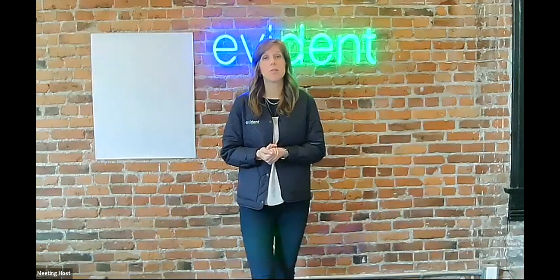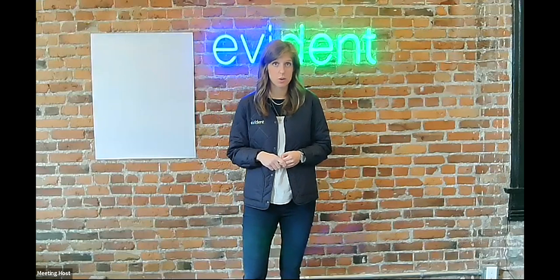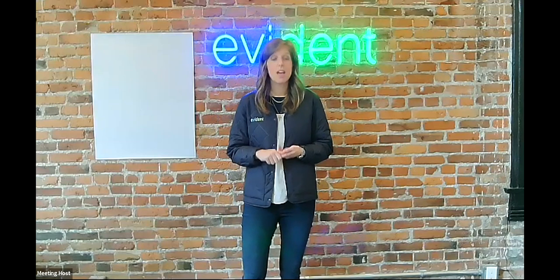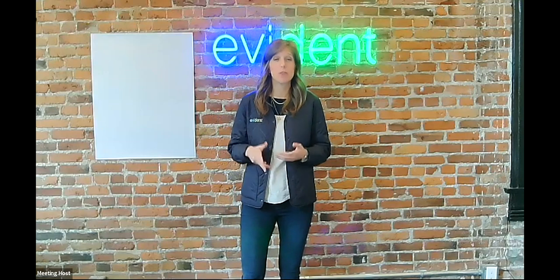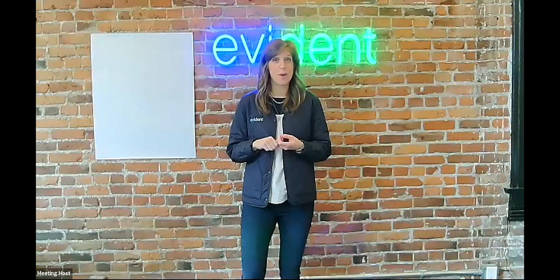So before we jump into it, we should probably talk about what is a dento. And you see I've shortened it up because dentofacial analysis is a bit of a mouthful. A dento is essentially an extraoral evaluation tool that's used to assess the tooth and the soft tissue relationship. It's also great for tracking your patient's oral health progression, and it's a great tool to communicate your anticipated outcome of your treatment plan with your patient and your lab. And if you present it well, it'll help you sell more too.